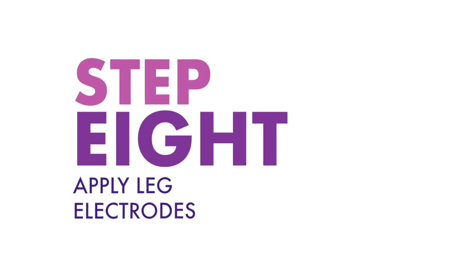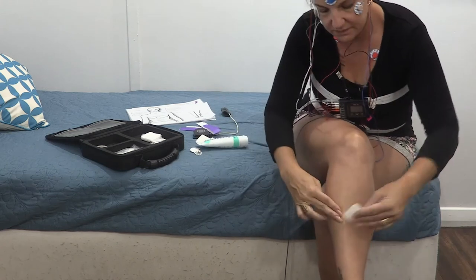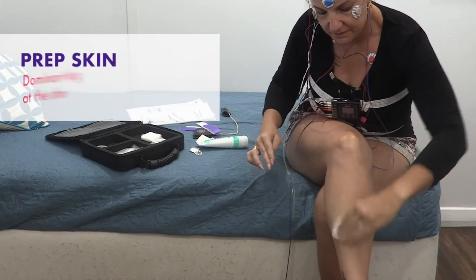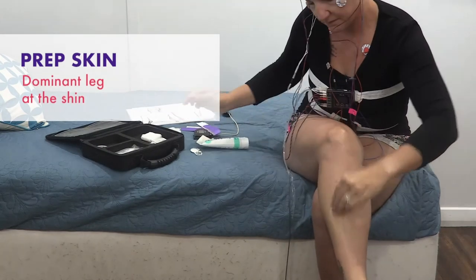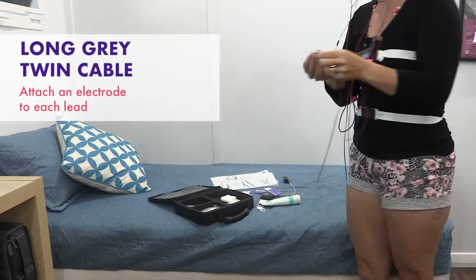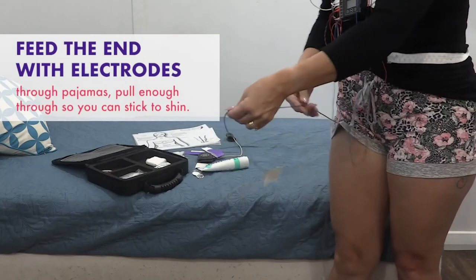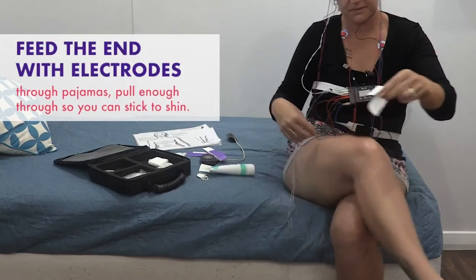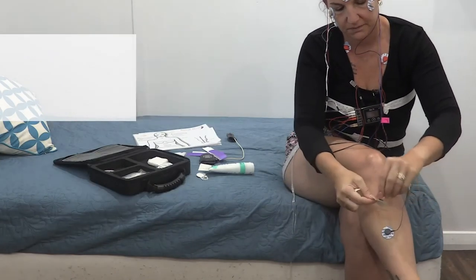Step eight: apply leg electrodes. These sensors will record any restless legs, sleepwalking or any other unusual limb movements during sleep. You will need to prep your skin for the leg lead placement on your dominant leg at the shin. Find the long grey twin cable and attach an electrode to each lead. Feed the end with electrodes through your pyjamas and underwear and pull enough through so that you can stick them to your shin, then tape the lead to your leg to keep it secure.